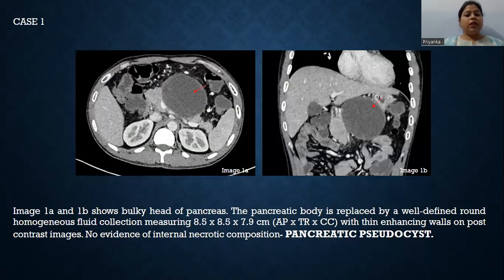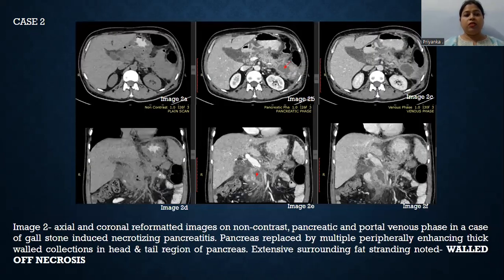The first case shows a bulky head of pancreas. The pancreatic body is replaced by a well-defined, round, homogeneous fluid collection with a thin enhancing wall on post-contrast images. There is no evidence of any internal necrotic composition, suggestive of pancreatic pseudocyst.